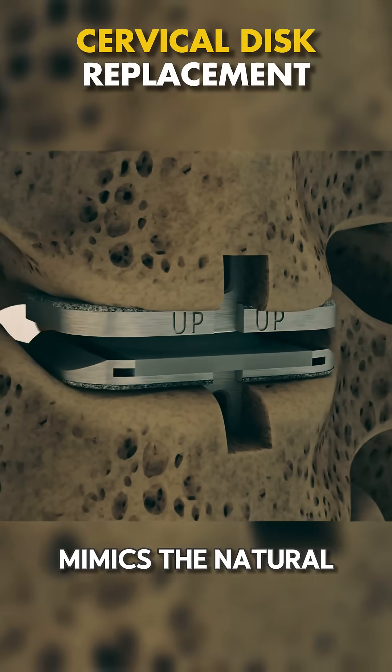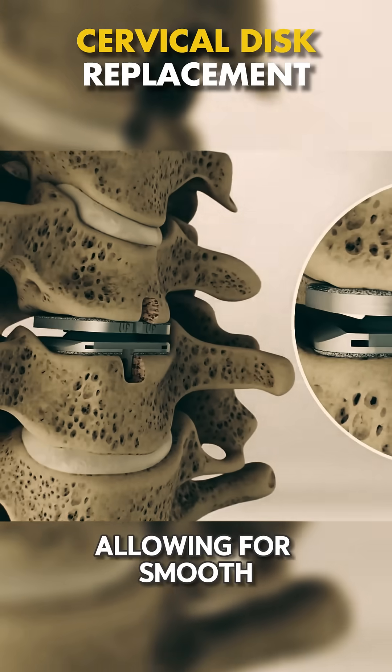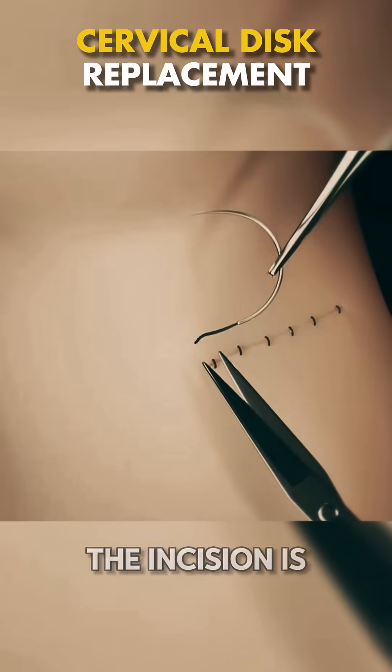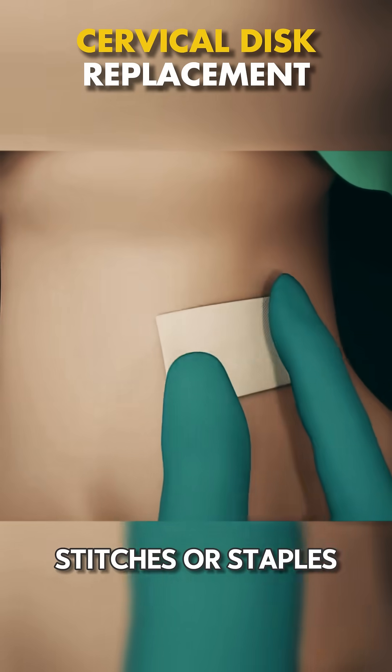The new disc mimics the natural disc's function, allowing for smooth neck movement and reducing pain. The incision is then closed with stitches or staples.